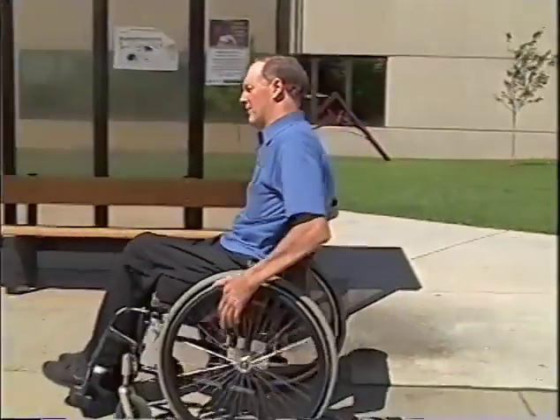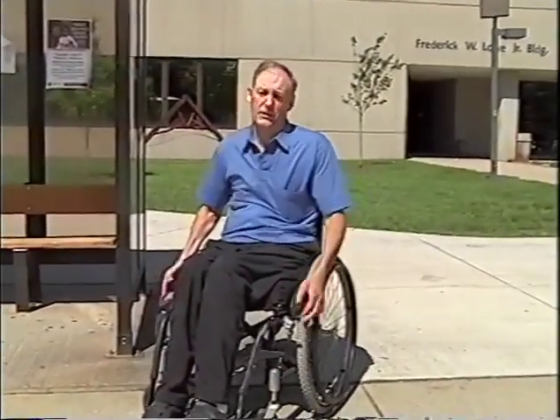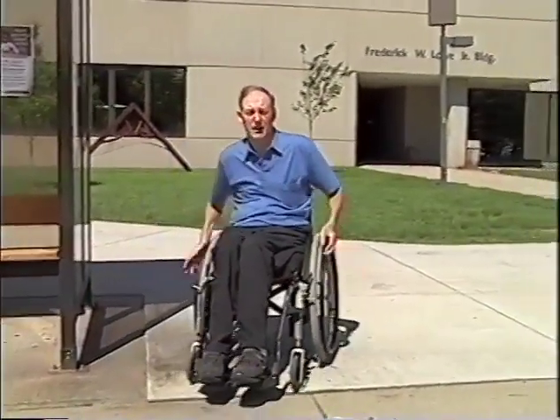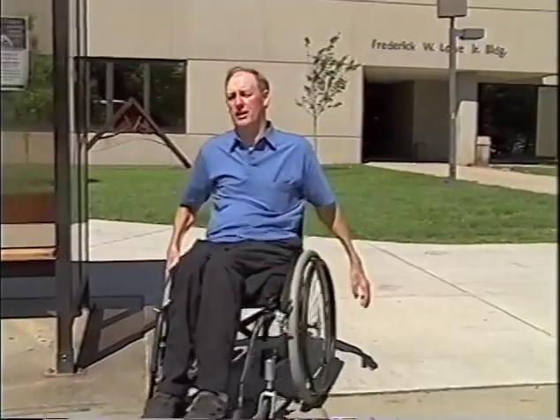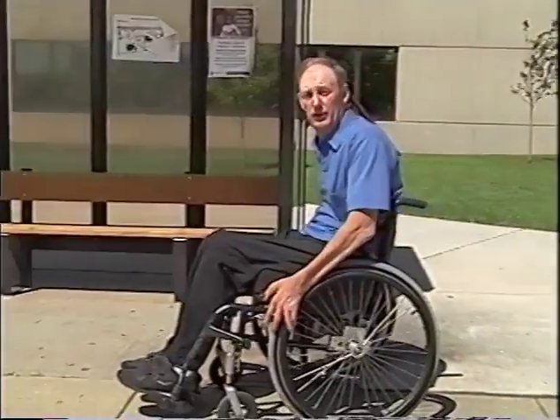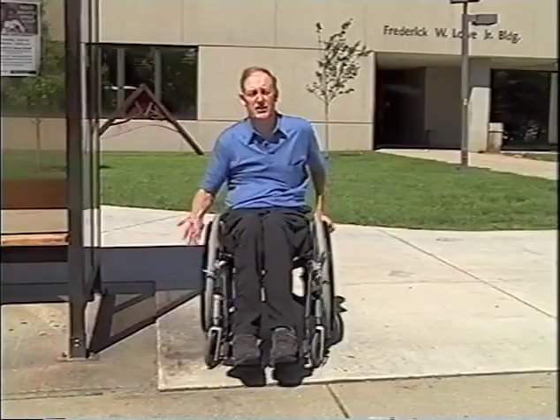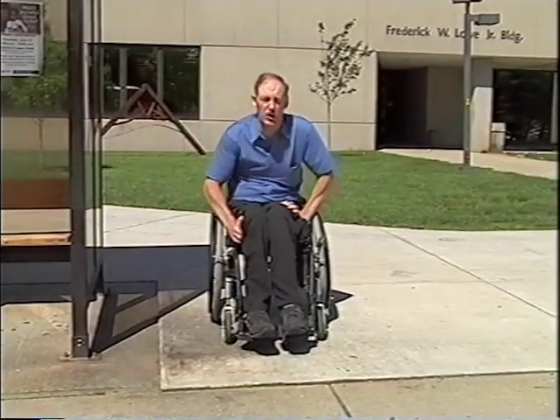The next thing I generally teach in wheelchair mobility is cornering. Now you have three main choices when you come to corners. The first is to come to the corner and slow the inside wheel down and make the corner. When you're talking about efficiency, it's perfectly all right to do that, but you're using your strength and you're losing your momentum by slowing down to make the corner. So you're paying twice for something that you've already put the energy into. So it's the least efficient way to corner.